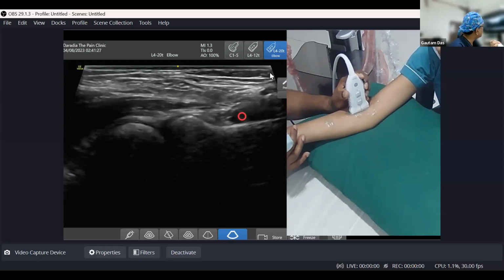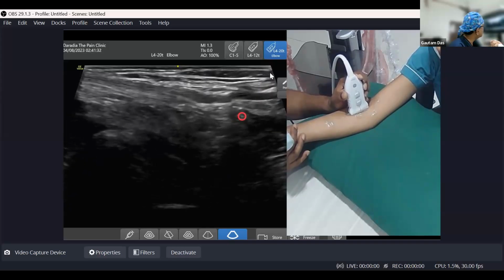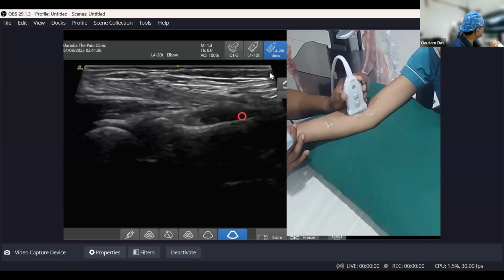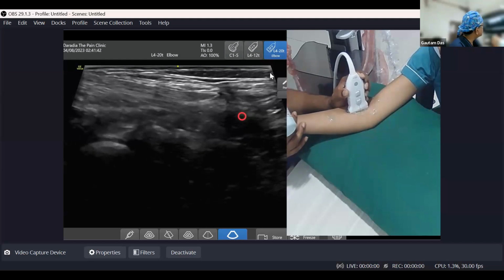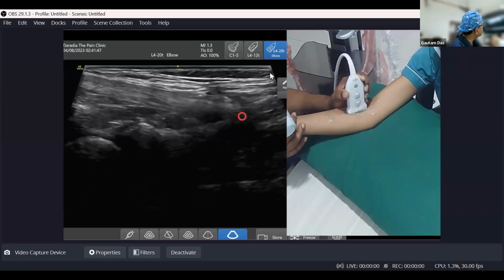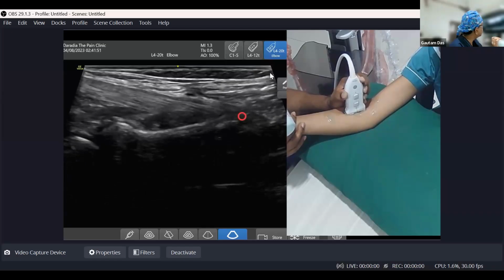And if I'm doing the heel-toe maneuver, you can see the whole tendon is getting attached here. And when you see the tendon nicely, you will not be able to see the radius. You can see the tendon getting attached there over the radius, over the tubercle.